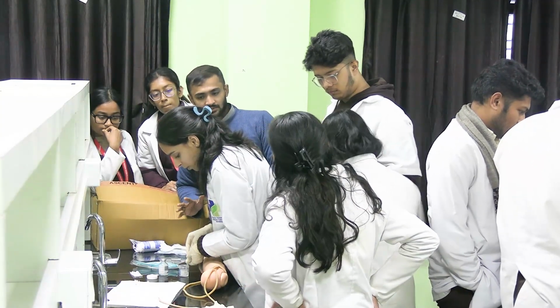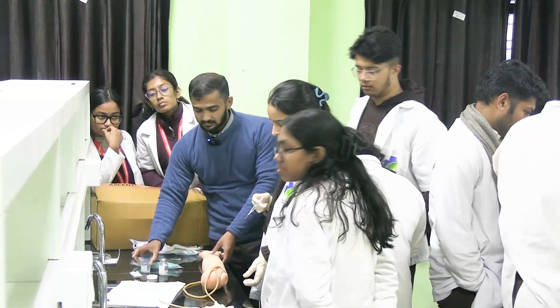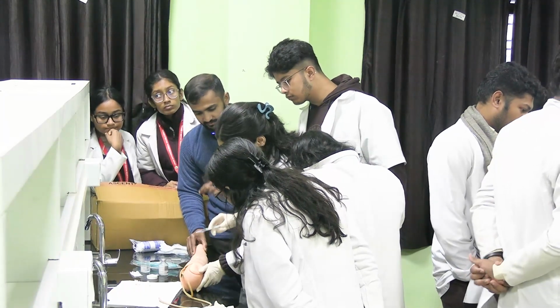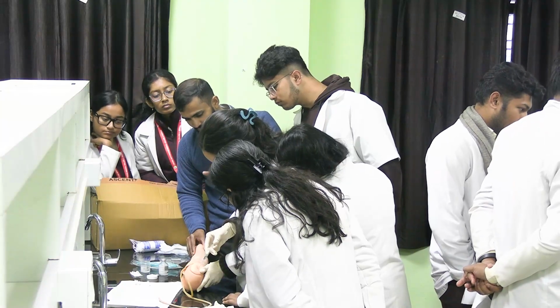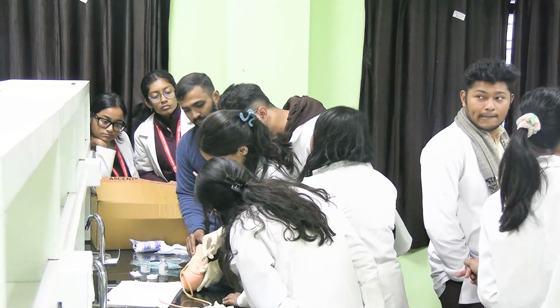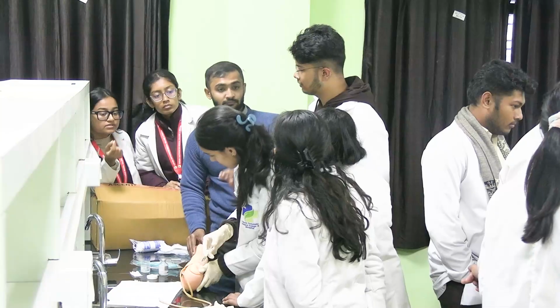Don't go fast, go slow now because you are learning. We know the site. We have stretched the skin. Now insert it perpendicularly, directly. Don't introduce the medicine. Go more. Suppose now you have gone into the muscle. What is the next step? Inject? No. We have to check.